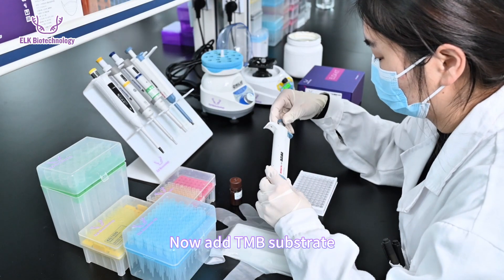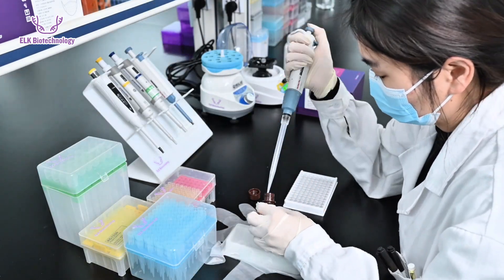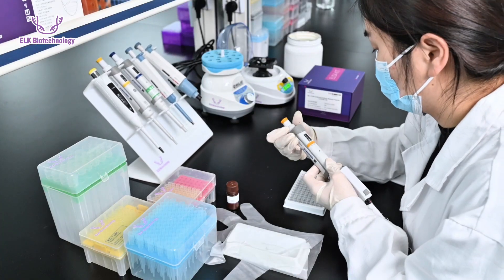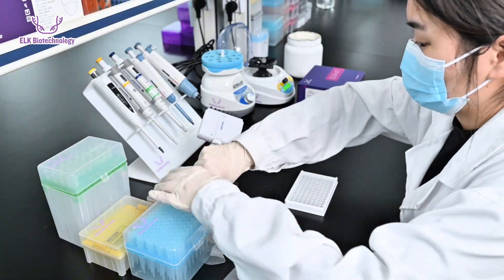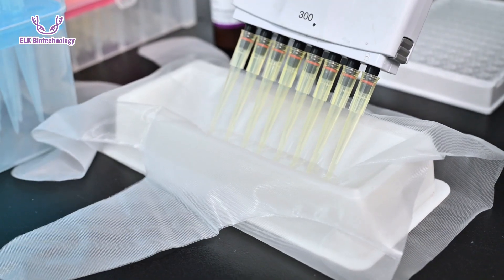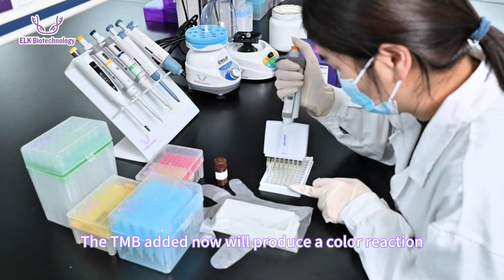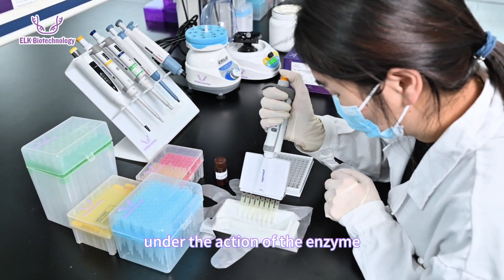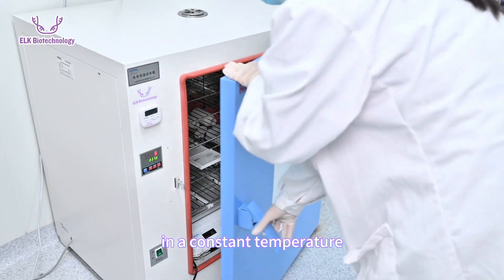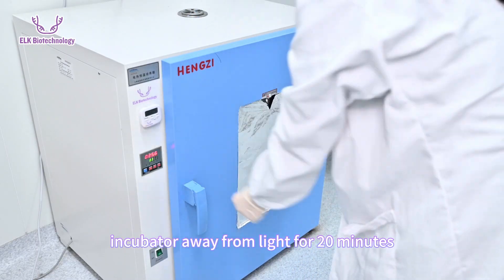Now add TMB substrate. The TMB will produce a color reaction under the action of the enzyme. After dispensing, incubate at 37 degrees Celsius in a constant temperature incubator away from light for 20 minutes.